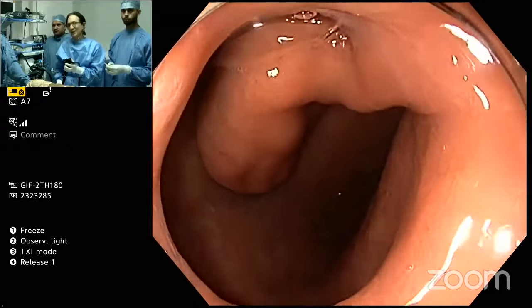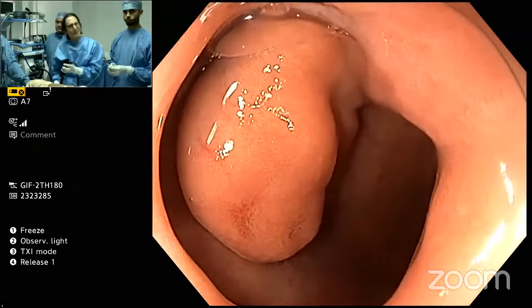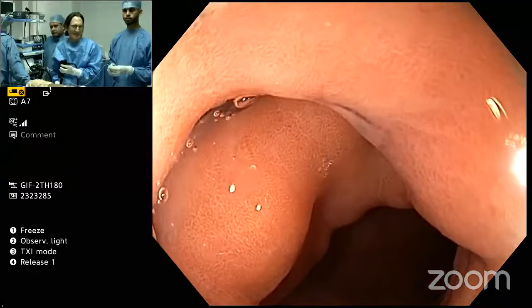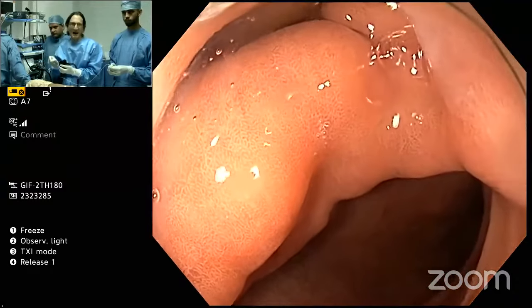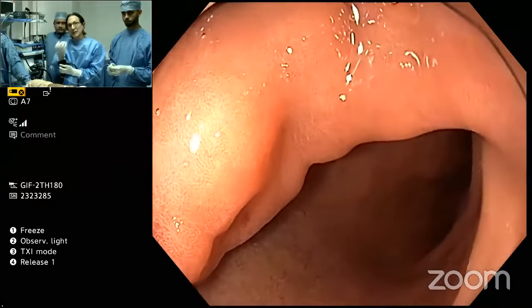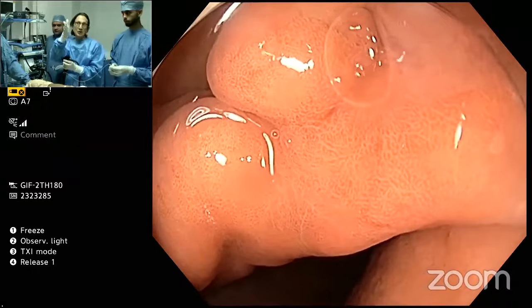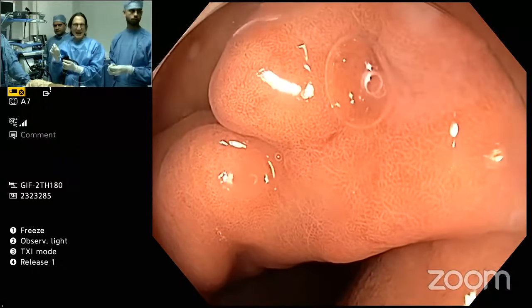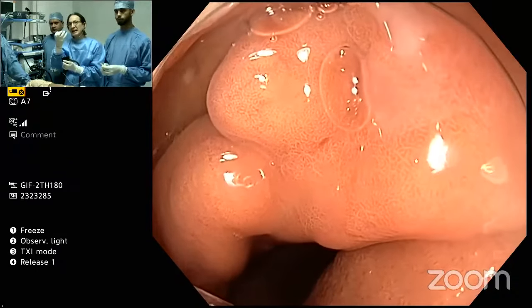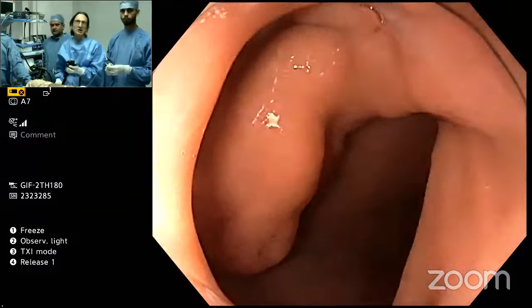But one thing to remember is that lipomas are very vascular. They bleed very easily. You don't think of lipomas as vascular, but they are. Whenever I remove lesions on the IC valve in the colon, I tell the nurses, be prepared with the coag grasper, with Purostat, everything, because these bleed because of the fatty tissue in the IC valve. So one thing you could do then is inject epinephrine into the stalk, the base. It's very broad-based. And the epinephrine will do two things. It will constrict the blood vessels, but it also will shrink the pedicle itself. So that would be certainly very reasonable to do.